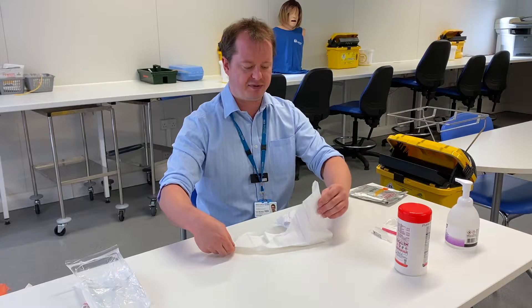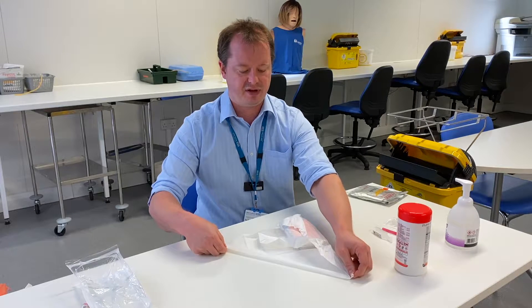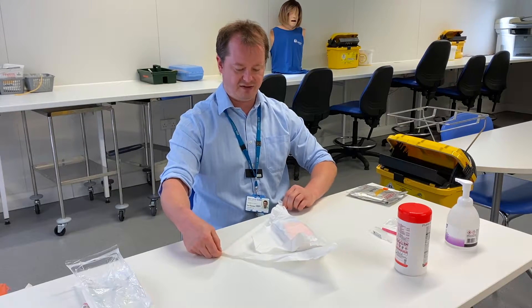Very carefully open it up, taking your time — the longer you take, the more control you'll have. Make sure you give it a nice good pull so it's nice and tight, so it sits nice and flat onto your chosen area.